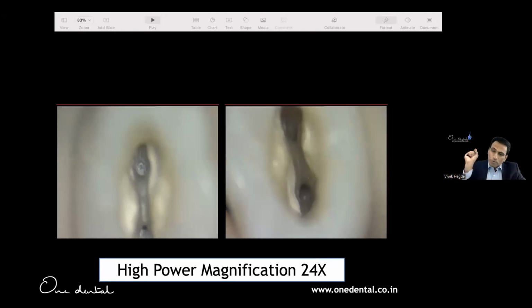The GP point, what I had put in the root canal system, would also go into this canal. Everything looks nice. When you obturate, maybe you'll get a puff, you'll get root canal sealer, condensation, looks all good. But sometimes I started realizing the root canal still started failing. Gutta-percha to a root canal space is like how suture is to a wound. When you suture a wound in any site, sutures don't heal wounds. What heals a wound is what? Irrigation, medication, and the rest. That is what we need to do.